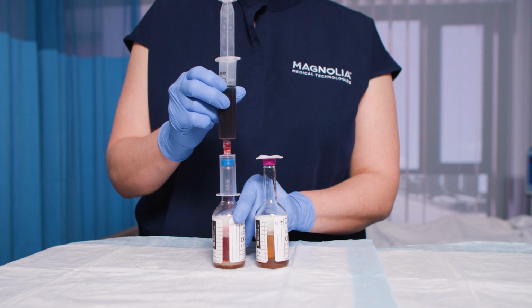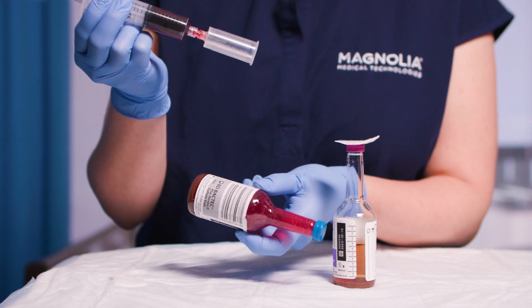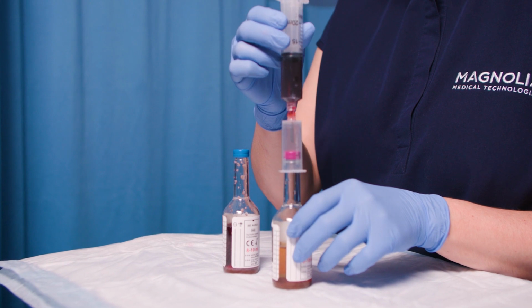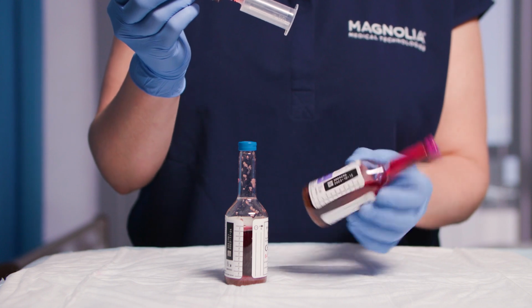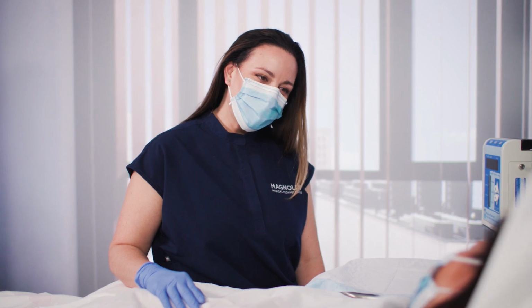Fill the culture bottle according to institution policy. Gently agitate bottle several times to prevent clotting. Follow the same procedure for inoculation of second bottle. Be sure not to introduce air into anaerobic bottle. Gently agitate bottle several times to prevent clotting. Lastly, dispose of supplies according to institution policy.